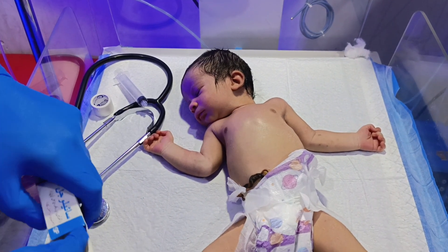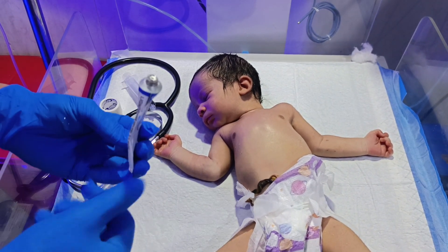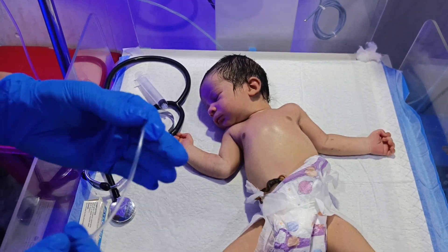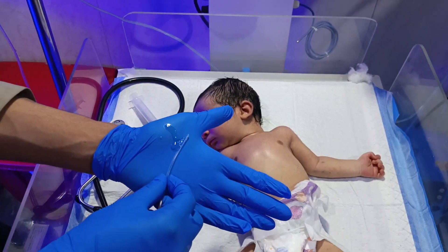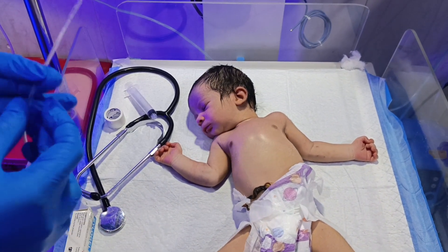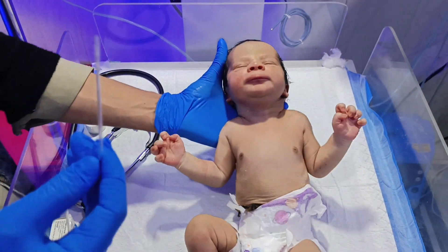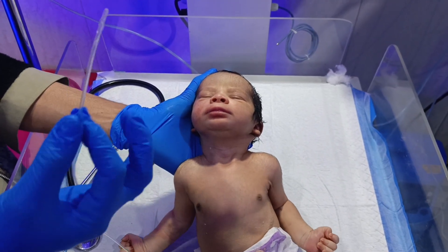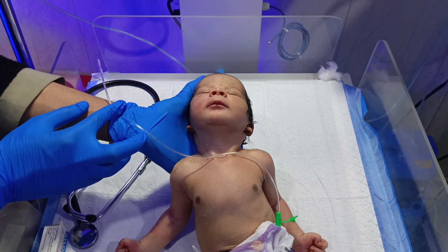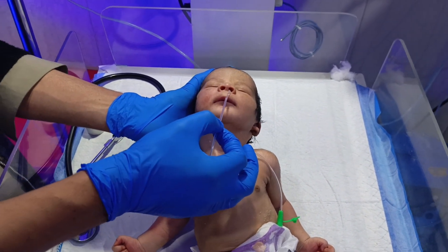We pass the tube step by step. This is the step-by-step procedure. We note the position of the baby. First of all, we find the measurement and confirm the situation — one, two, three — checking the length that is appropriate and compatible for this patient.